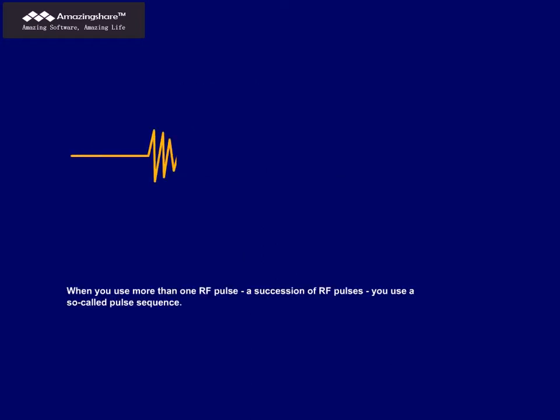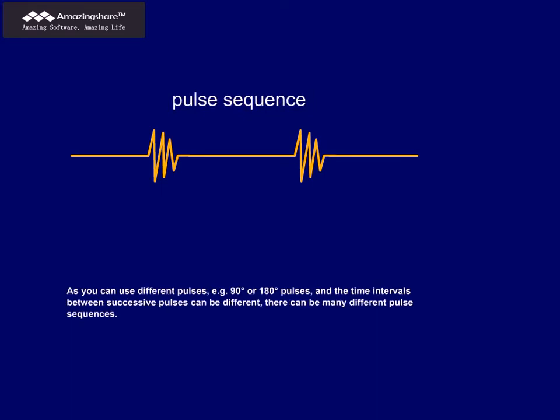When you use more than one RF pulse, a succession of RF pulses, you use a so-called pulse sequence. As you can use different pulses, for example, 90 degrees or 180-degree pulses, and the time intervals between successive pulses can be different, there can be many different pulse sequences.